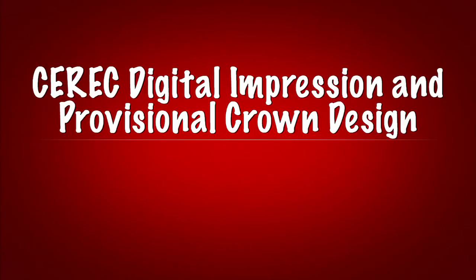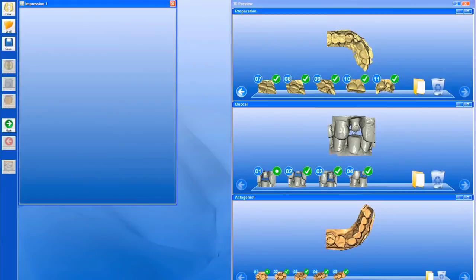Let's take a look at the CEREC side of this, using 3.8 software and biogeneric software.